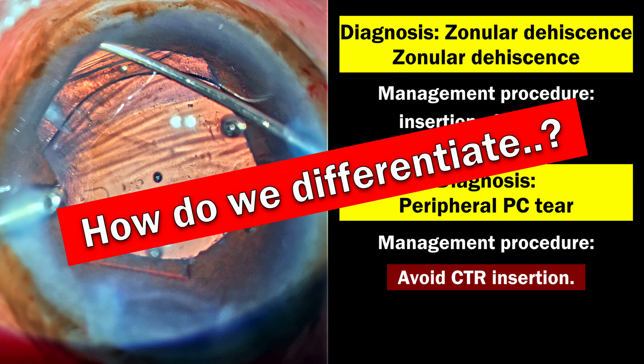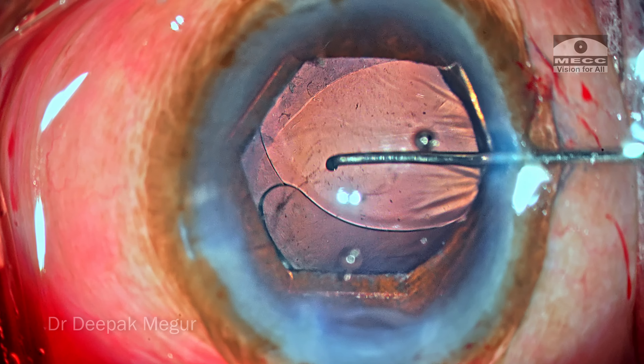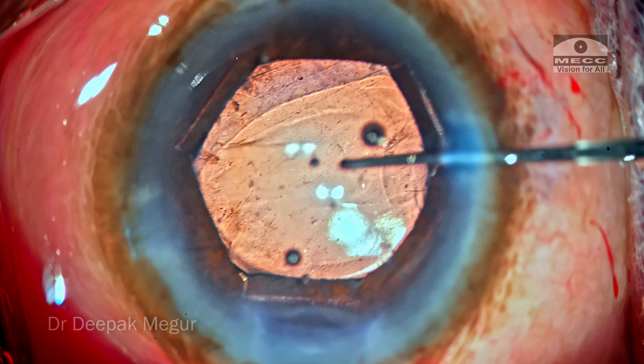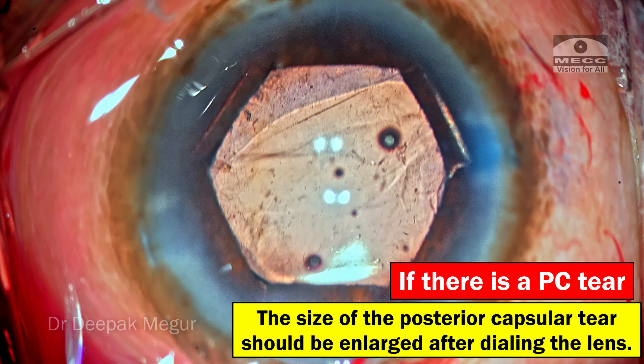What we're seeing is crumpled capsular bag in that region with radiating lines both at the equator and in the posterior capsule. I nudge and dial the lens a little bit — if there is a posterior capsule tear, I expect it to enlarge when I dial. The lens does not decenter significantly. I trace the lines on the posterior capsule to check for any discontinuity, and it doesn't seem to be that.